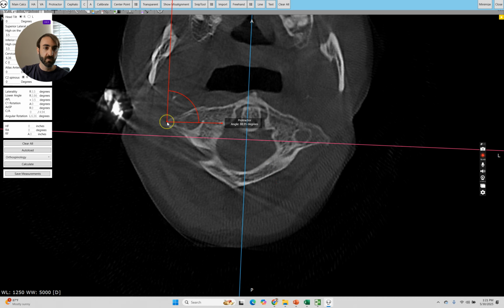And the more you measure, the more numbers you get. You kind of just want to pick what looks best, feels best, agrees with most of the structures, or else you'll drive yourself crazy on cone beam, right? That's the good and the bad of cone beam. You can see more, which means you can measure more. When you can measure less, you got something faster, but it wasn't necessarily the truest representation of what's going on.